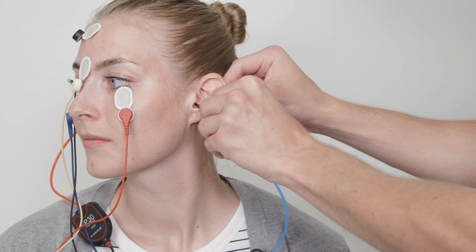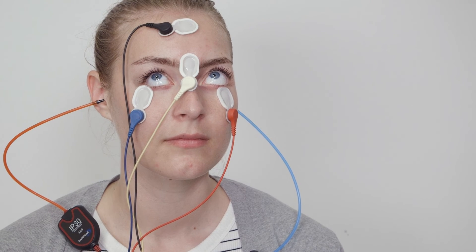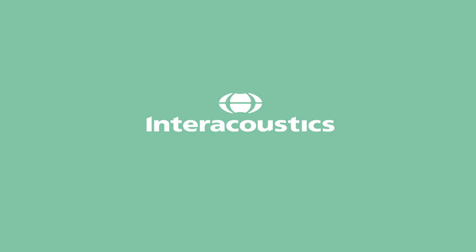Insert the transducers and instruct the patient to keep a constant upward gaze during testing without moving their head. You do not need the EMG monitor for OVEMP.